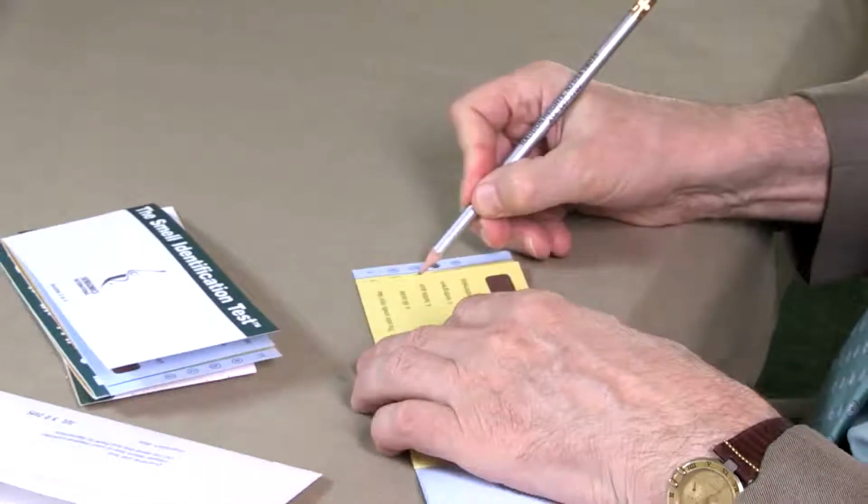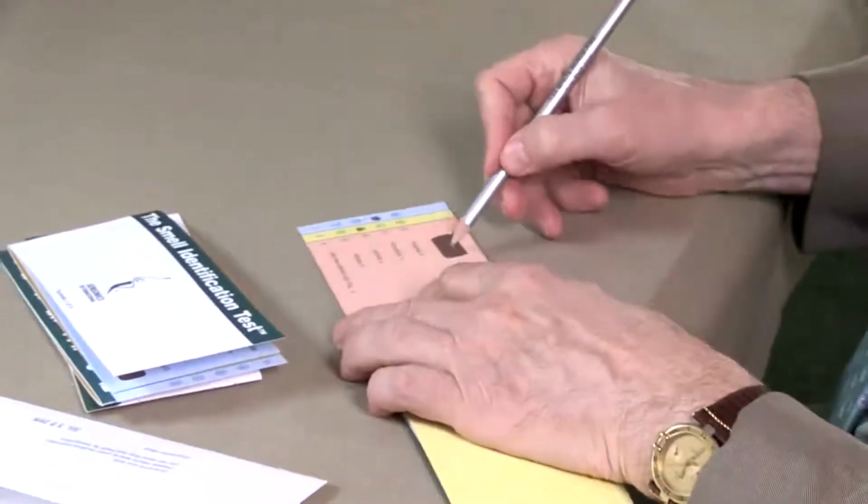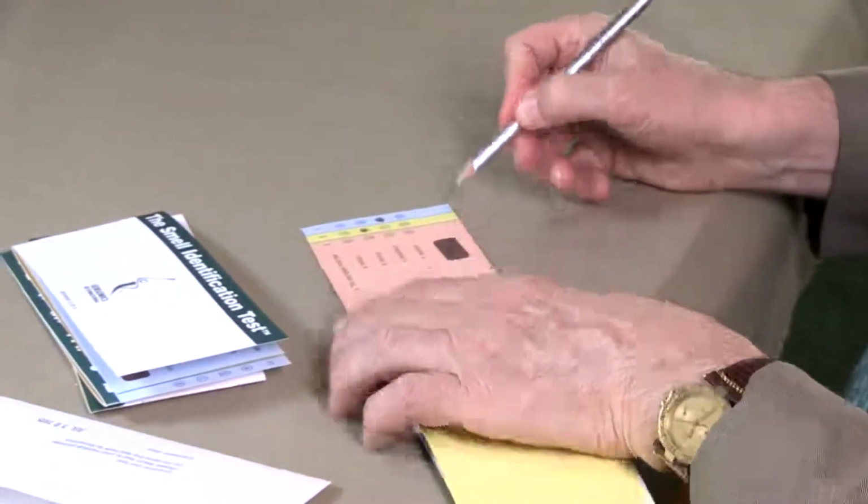We go to the next item. Again, we mark with a Z, a couple of lines through there. Big sniff. Does that smell like dill pickle, bubblegum, wintergreen, or watermelon? Bubblegum. Bubblegum, okay? So we fill in the answer B. This is very straightforward. We go through and do this through all 4 booklets.